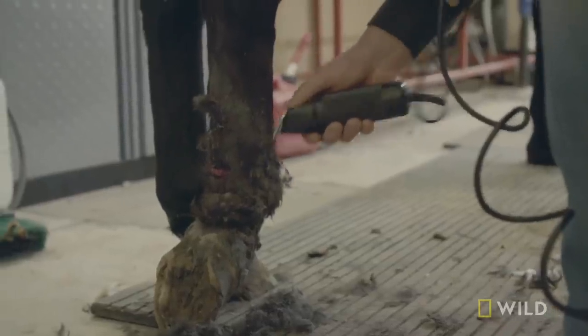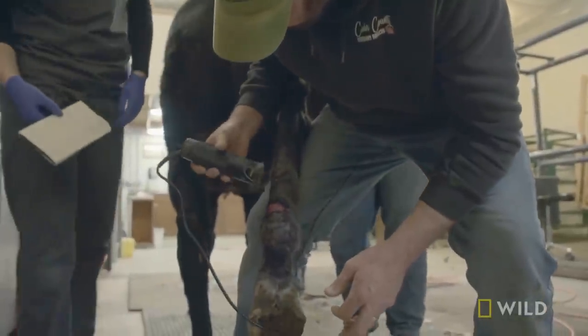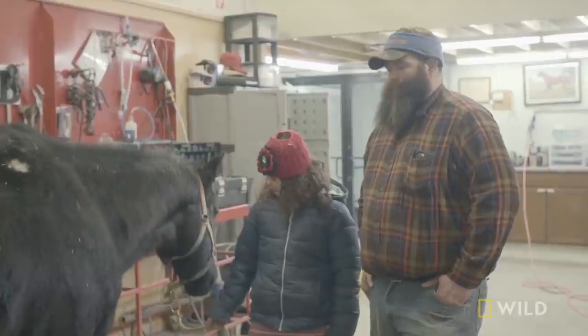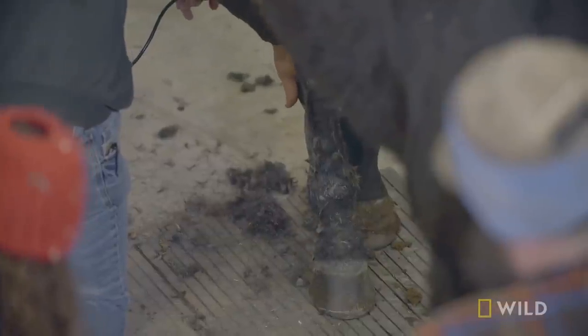What we're going to do now is give him a little bit of support again with another bandage, but it won't be a cast. We can tell that the tendons have formed scar tissue because we can feel it as we palpate his leg. Here's the wound. And when he puts his foot down, his toe is staying down — we're not seeing that toe pop up. Those are both great signs that everything is healing like it should.